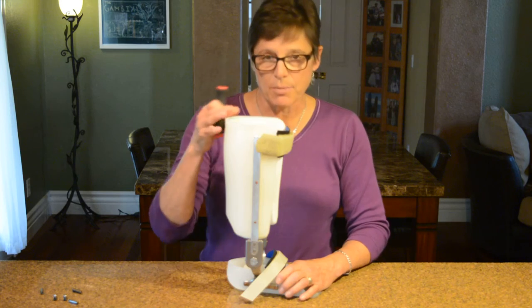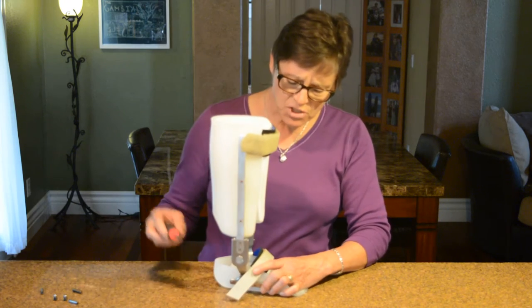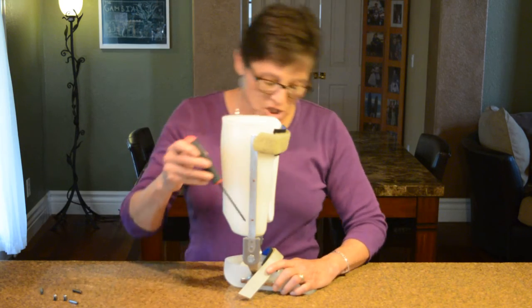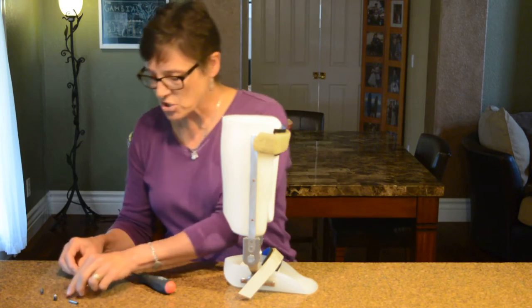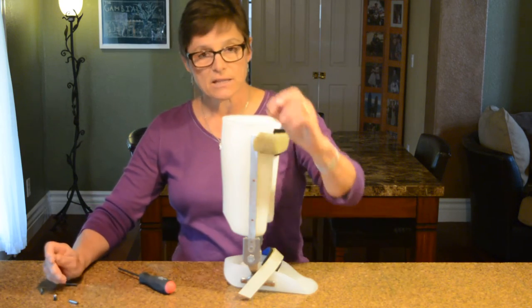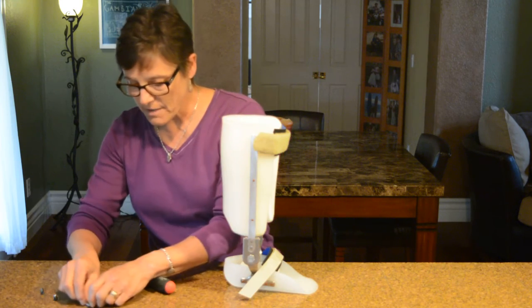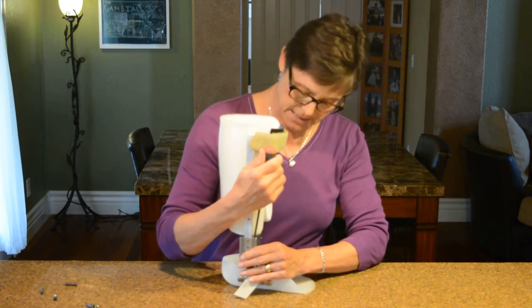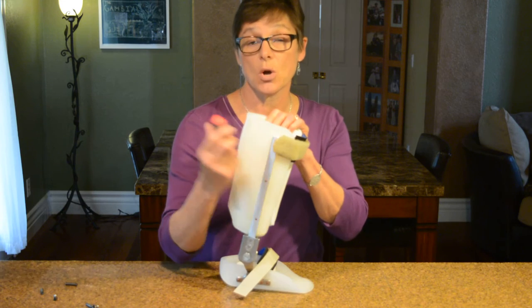The double adjustable AFO has two ankle joints on it, and essentially it has two channels — an anterior channel and a posterior channel. The channels have little screws in them. In each one of these channels there is a little ball bearing, a little screw on top, and a little pin that goes inside the channel.